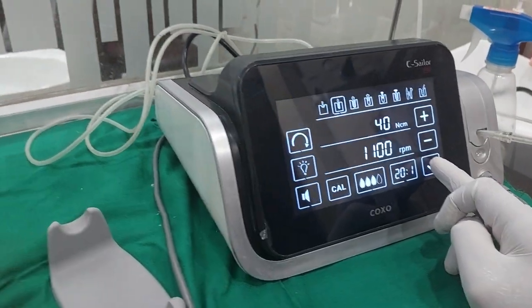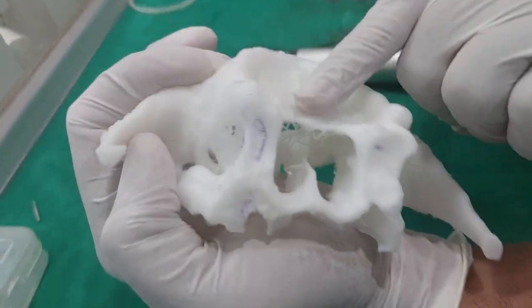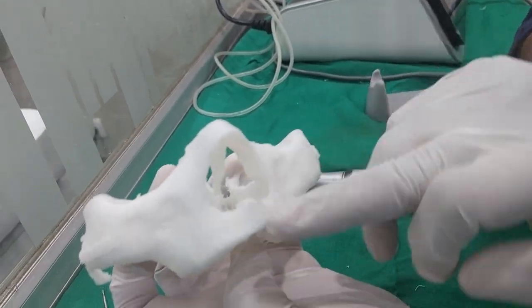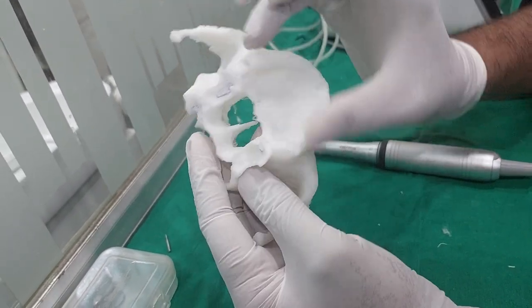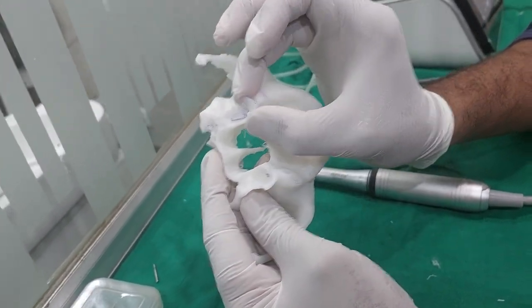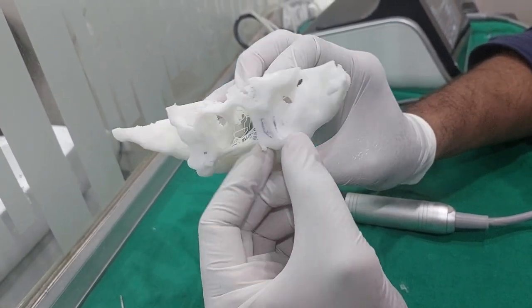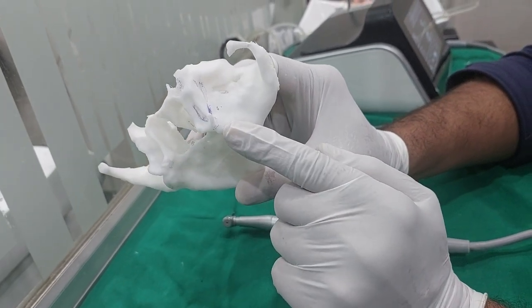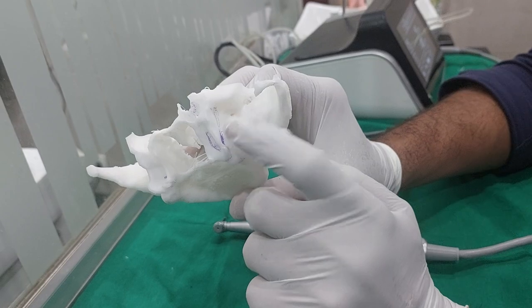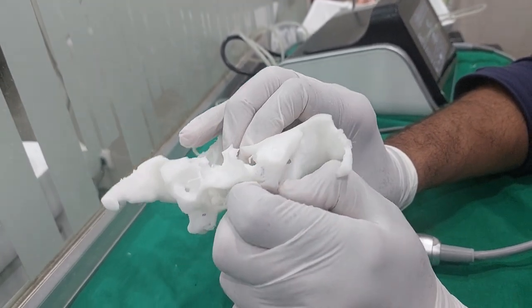This is now the STL model. Let's look at the anatomy. This is the maxilla, anterior nasal spine, nasal aperture, alveolar process. And now see this is the pterygoid region. What is a pterygoid implant? A pterygoid implant is basically an implant that goes through the tuberosity and reaches to anchor to the pterygoid plates or the cortical bone between the fusion zone.